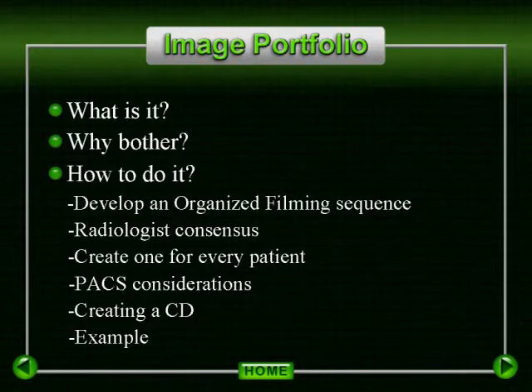We have subsequently begun burning CDs only with our significant image file, as we feel it gives an overview of the case as well as shows all the significant findings. We place a standardized note within the CD file stating that the CD is provided only with significant images. If all images are felt necessary, these can be provided as requested, and so far no one's made this request.